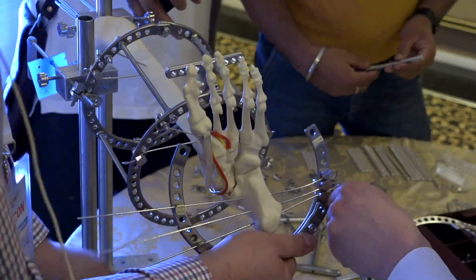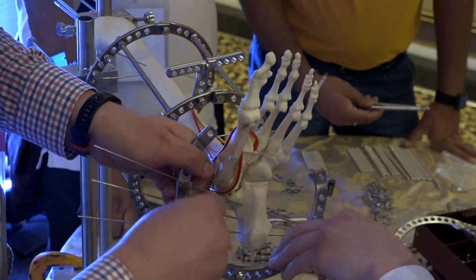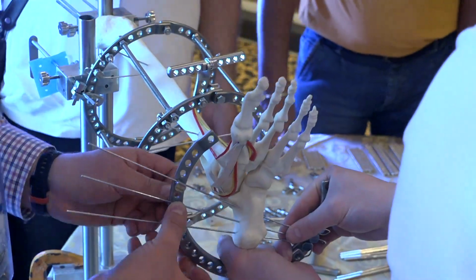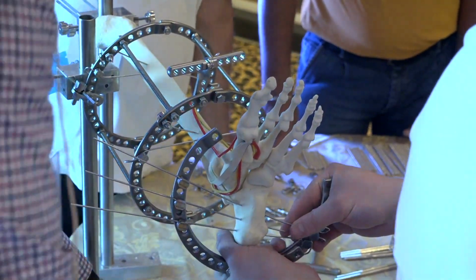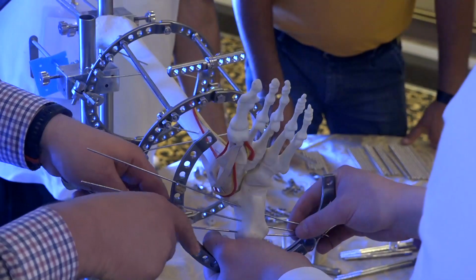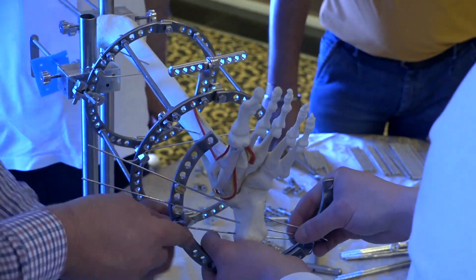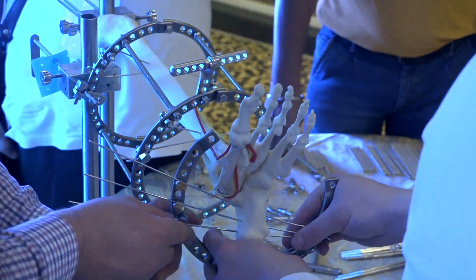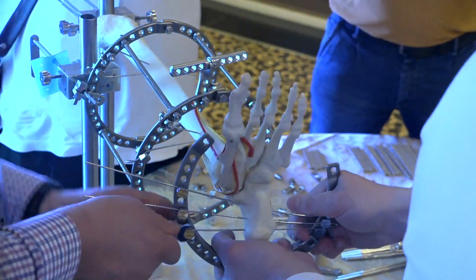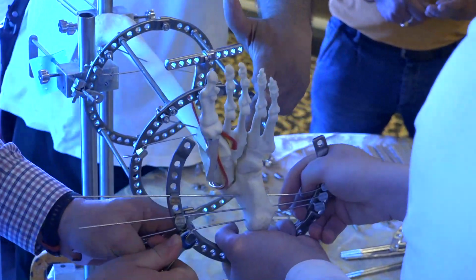Can a patient walk on this frame? After deformity correction, the patient can walk with the frame, and it's one important condition that after deformity correction the patient should start and should walk in the frame. It's important for faster healing of the wound, faster healing of the bone, and fusion of the bones. In case of fractures, he can walk. Yes, in pilon fractures, it can be applied.